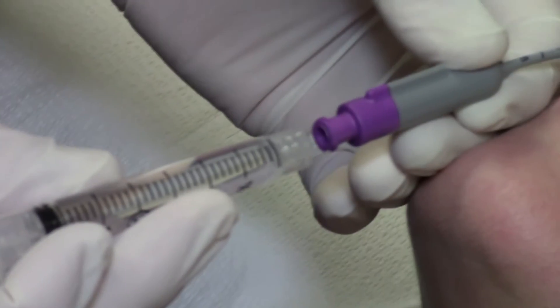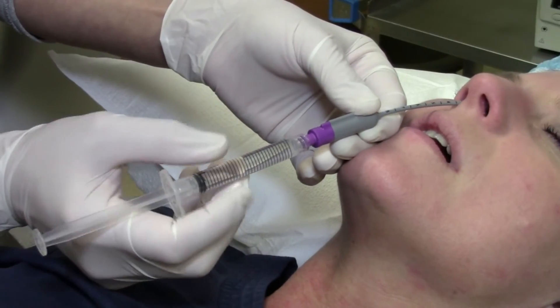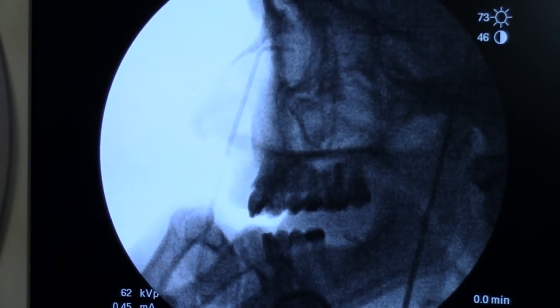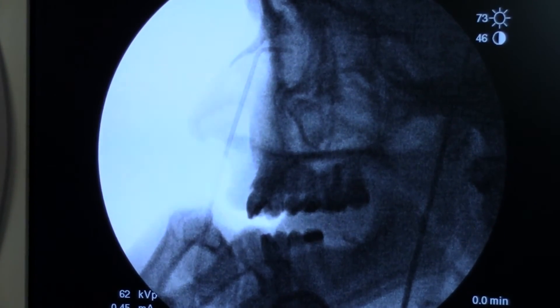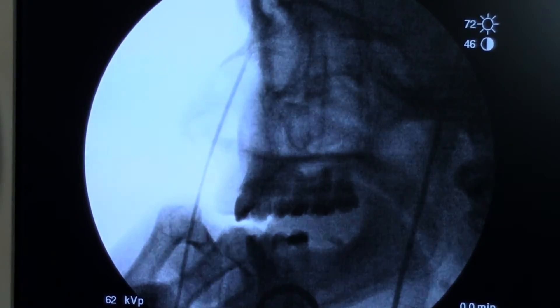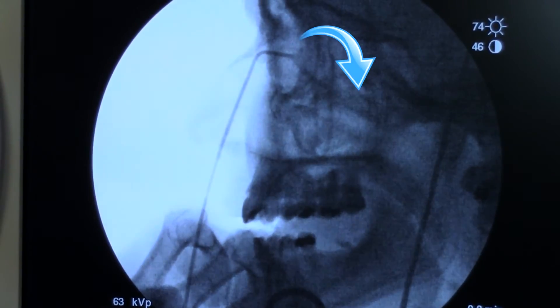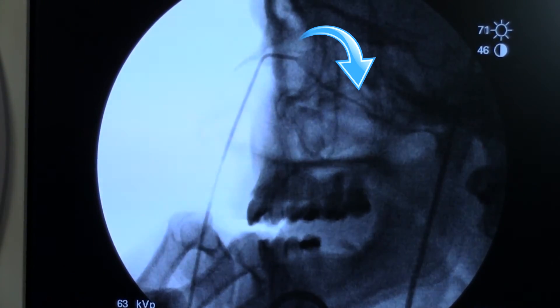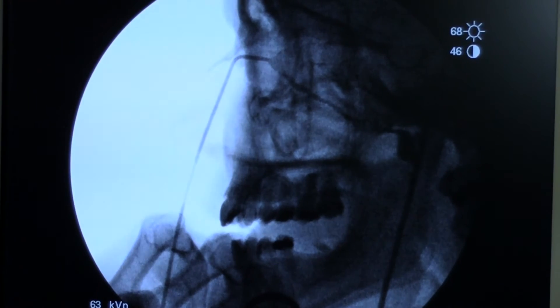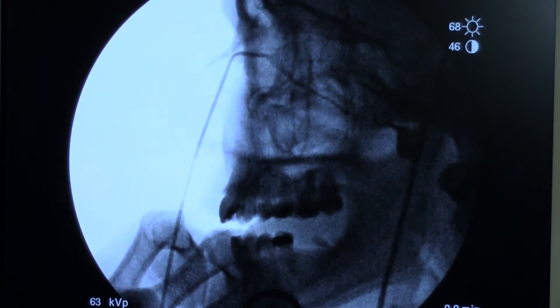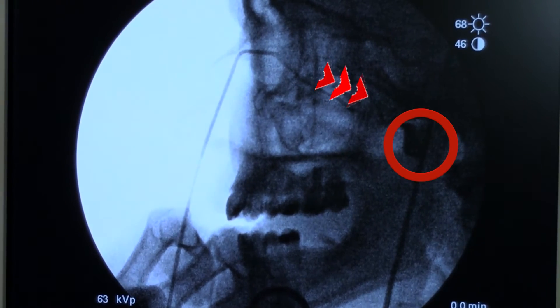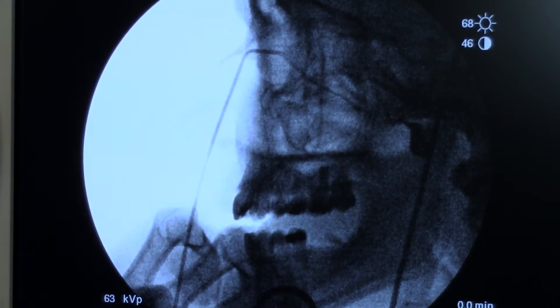I am going to attach the syringe with contrast to confirm the placement of the sphenocath. I am going to inject a small amount of contrast, and we can see it traverse the middle turbinate to the pterygopalatine fossa, where, of course, the sphenopalatine ganglion lies. We can see the contrast flowing right to the pterygopalatine fossa.